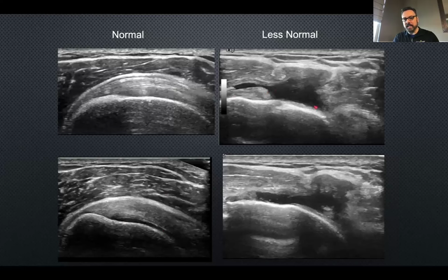And inside this big divot is replaced by this big giant area of void. It's just all black. On ultrasound, what black is like this, when it's this pitch black, is fluid. It's an effusion or an edema, and that's what's happening. This patient has a full thickness tear through the supraspinatus.